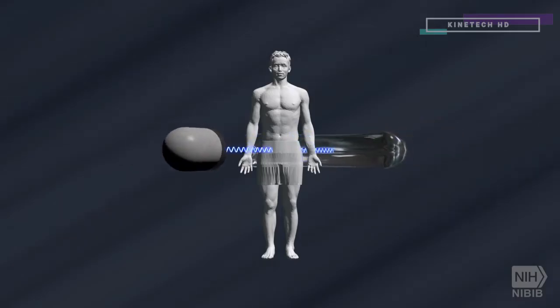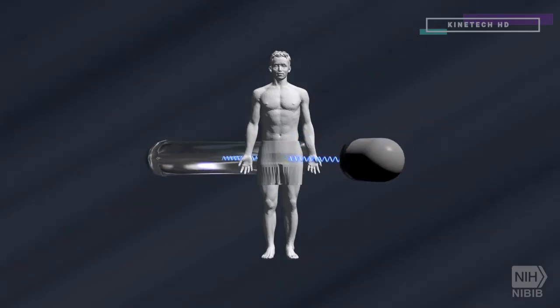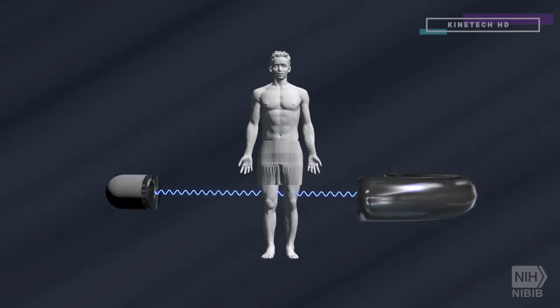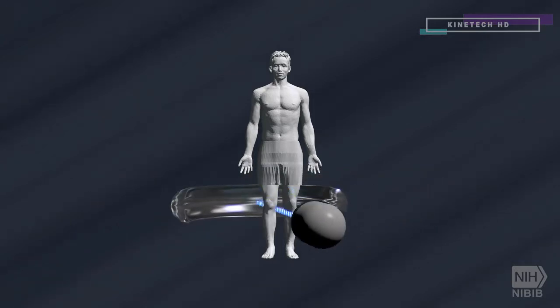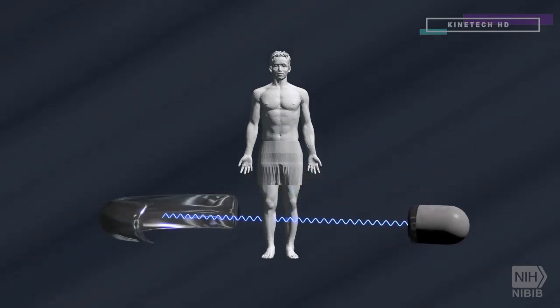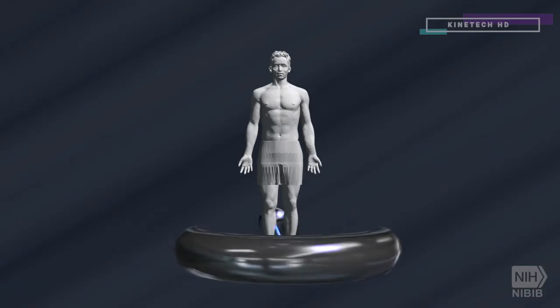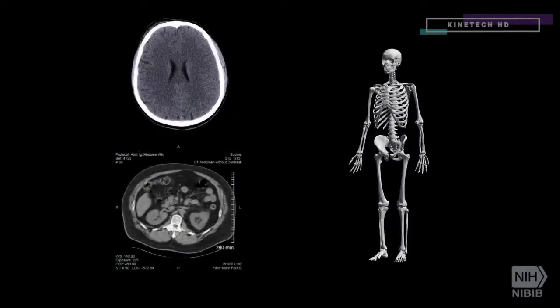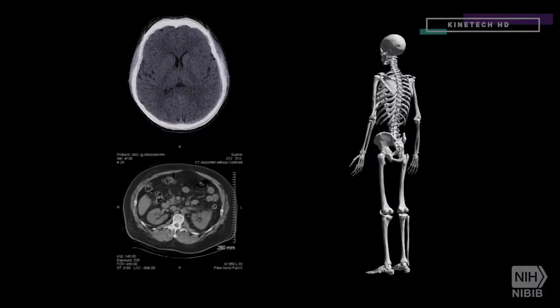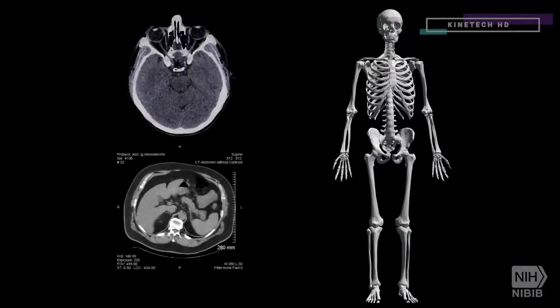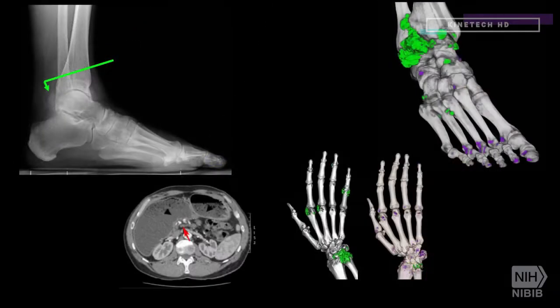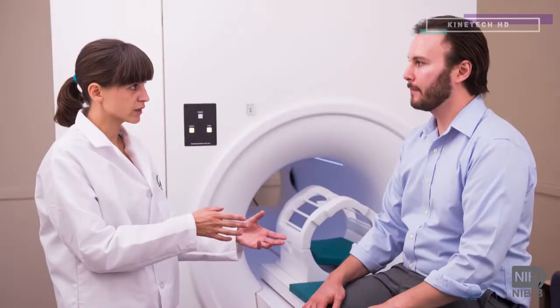There are special digital x-ray detectors located directly opposite the x-ray source. As the x-rays pass through the patient, they are picked up by the detectors and transmitted to a computer. Image slices can either be displayed individually in two-dimensional form or stacked together to generate a three-dimensional image that can reveal abnormal structures or help the physician plan and monitor treatments.